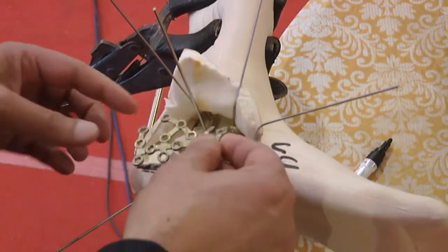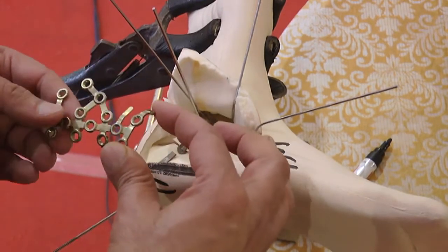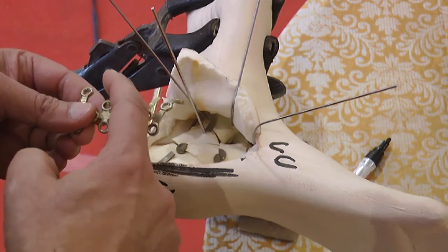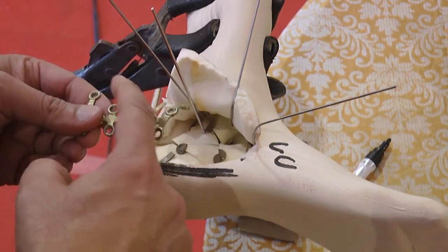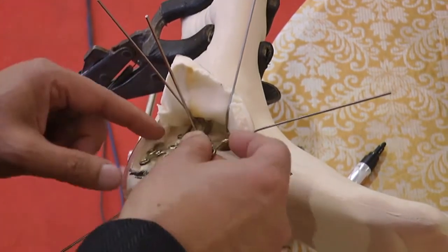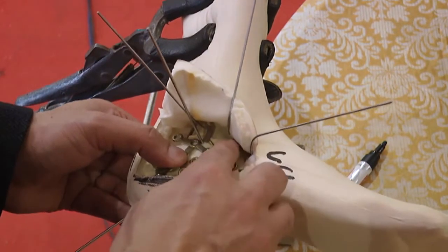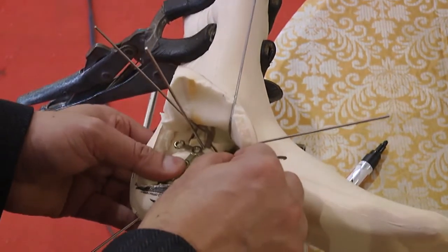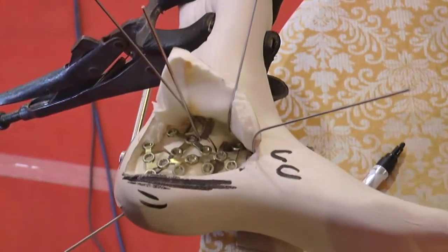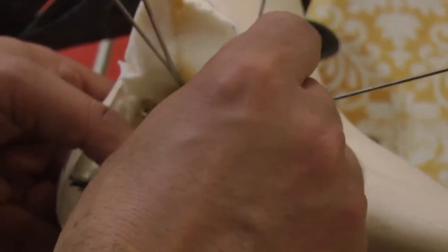So this plate is malleable. The anterior part of the plate is meant for the cuboid, and this angle arch is meant for sustentacular screws below the thalamic screws, holding the lateral facet to the medial calcaneal, medial sustentacular fragments. So we have a locking sleeve. Once you put that plate, you'll see how malleable that is.